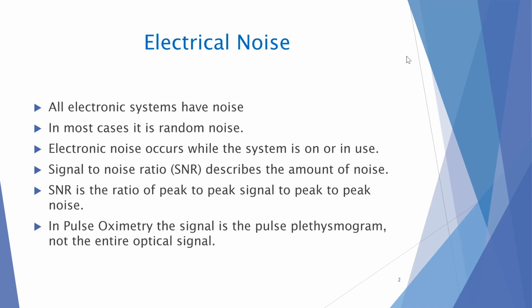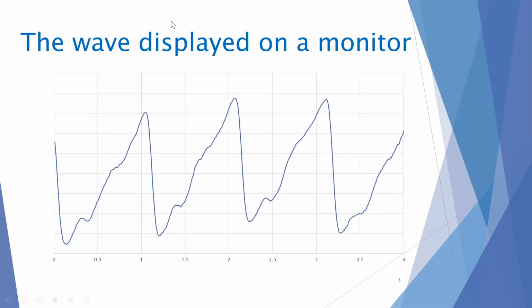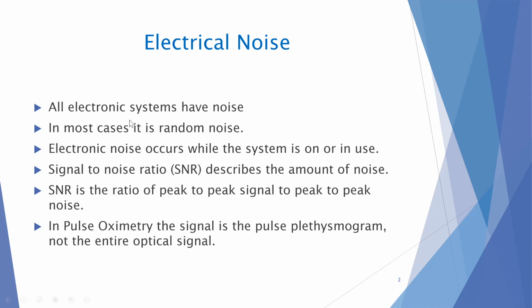We are currently collecting data on that point. We now have a study where we are actively warming and cooling subjects' hands differentially. So we have the same oximeter on different hands, one hand warm, one hand cold. That will be helpful towards answering your question.